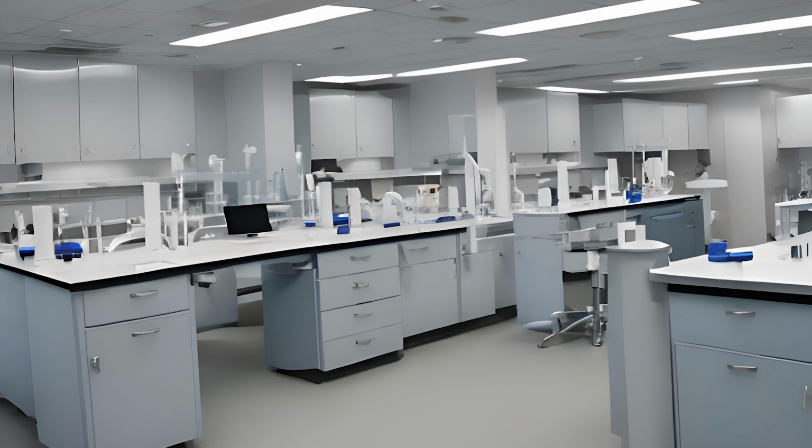After you've cleaned the site, we're now going to prepare our equipment. We clean the site before we prepare our equipment to give the alcohol time to dry on the person's arm. One of the number one causes of pain from this procedure is somebody being too hasty and not waiting for the alcohol to dry. If you push a needle through wet alcohol on somebody's arm into their vein, you have just pushed isopropyl alcohol into somebody's skin and into their vein, and it's going to sting. It's going to hurt, and it's going to amplify the pain caused by the procedure.